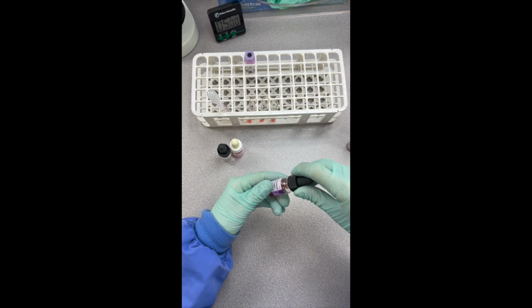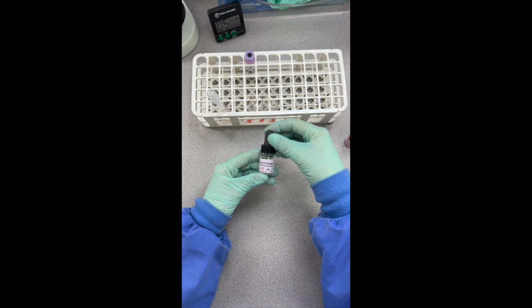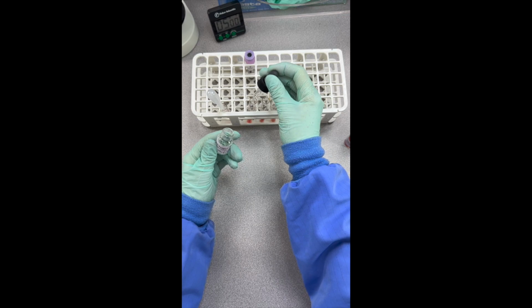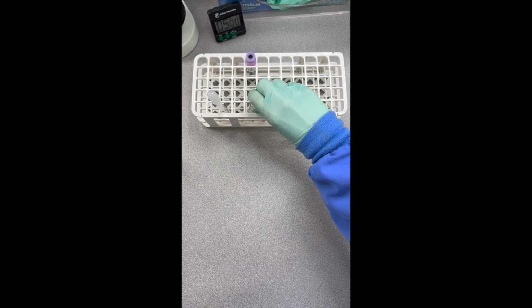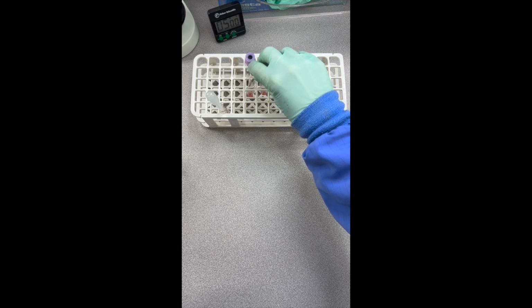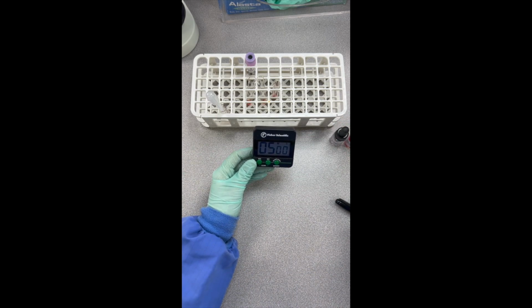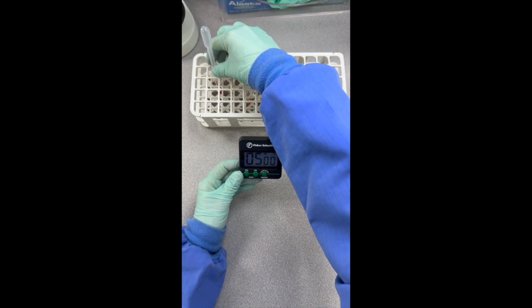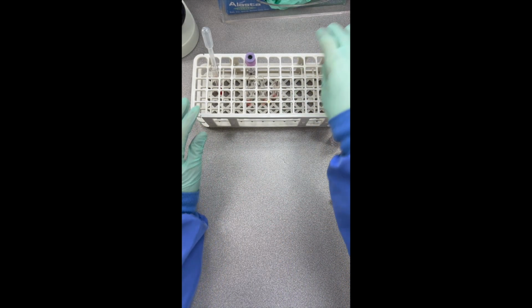Very good. Now, the next step is we're going to put our anti-D reagent in there, and then I will explain this. I have a little picture here we'll talk about. So we put 1 drop into each of our tubes, and then we're actually just going to set these back here for 5 minutes to incubate. So I'm going to set my timer, and depending on your manufacturer that you get your fetal screen from, you may have slightly different incubation times and so forth, and you'll just want to follow the standard operating procedure or SOP at your facility.